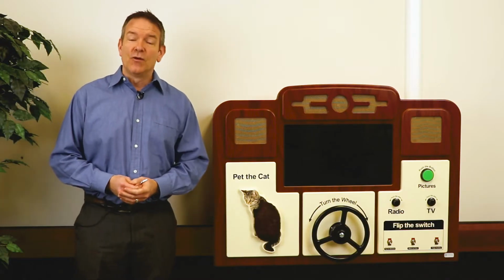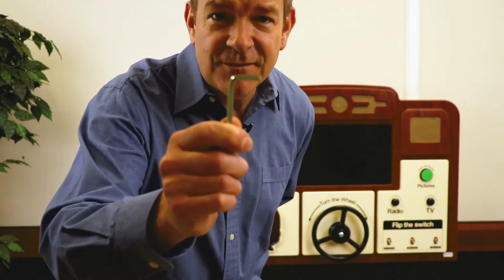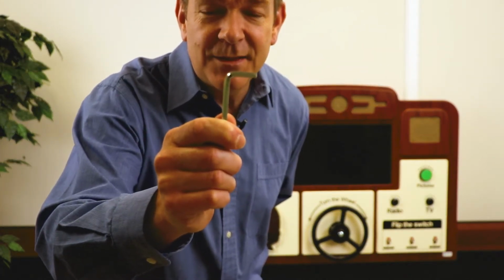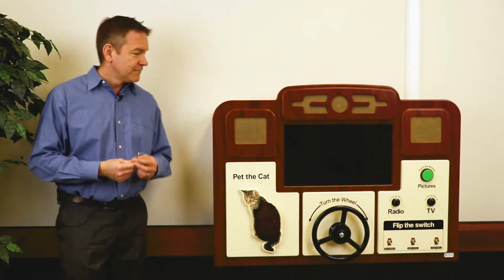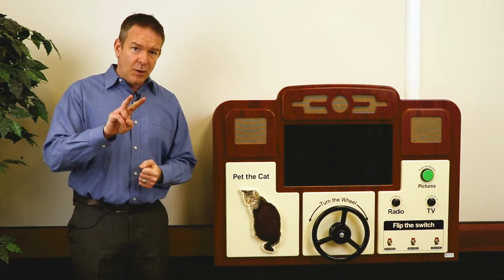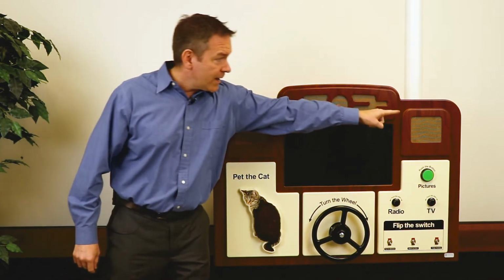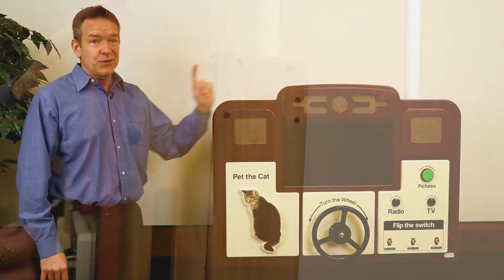Step 2. Remove 2 bolts. The only tool you'll need here is a 5mm Allen key, and this will be included in your hardware kit that comes with ABBY. There are 2 50mm bolts located at the top right and the top left of the ABBY. Let's start with the top right bolt.